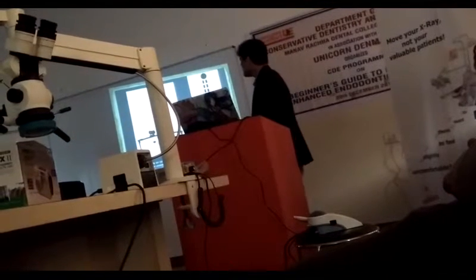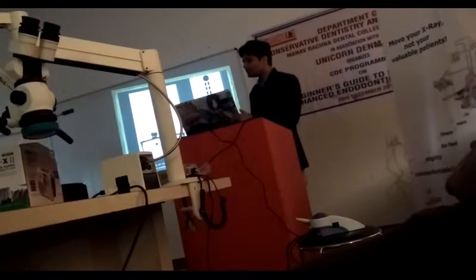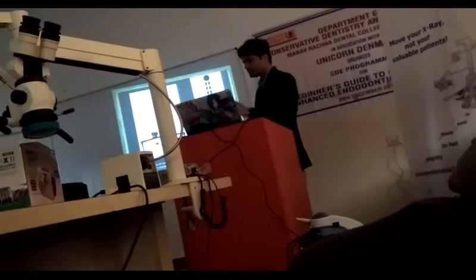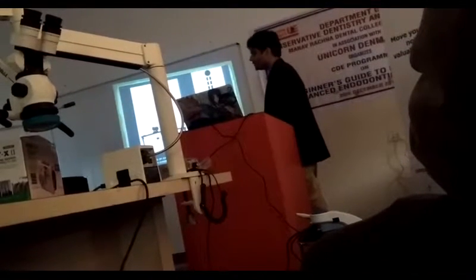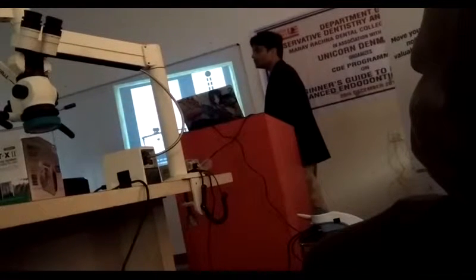The second most important thing is that with the help of a loupe, even the slightest movement will cause disruption. You will never refocus on the thing you were focusing on. So the focus will be jeopardized, and the other important problem is eye strain and fatigue. With the help of a microscope, there is a parallel orientation of the beam.